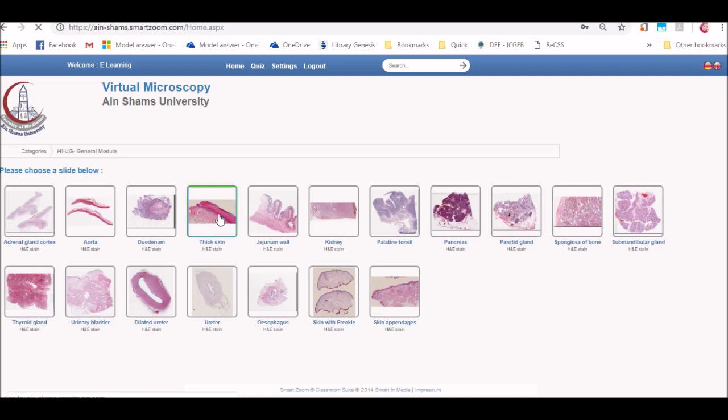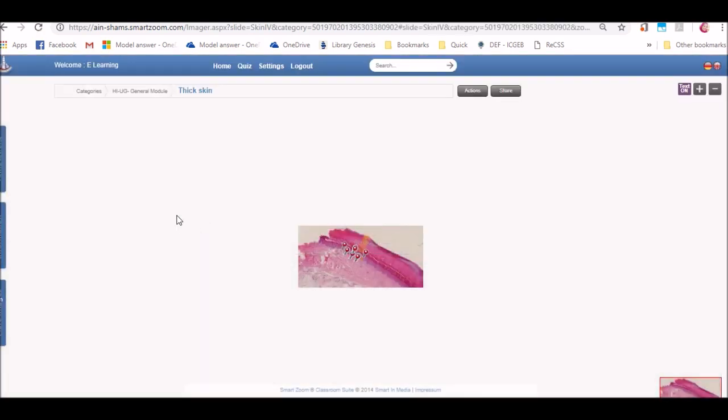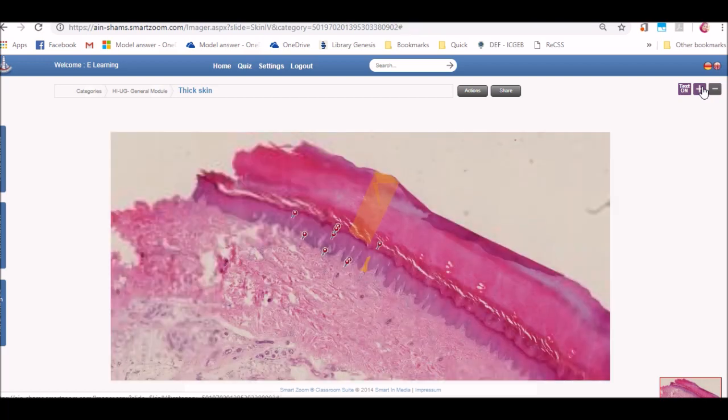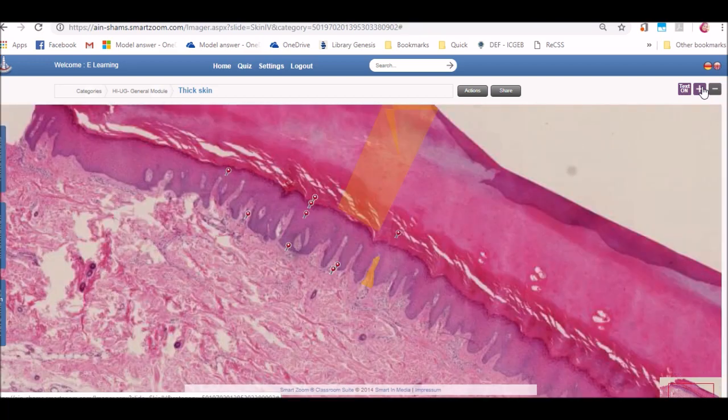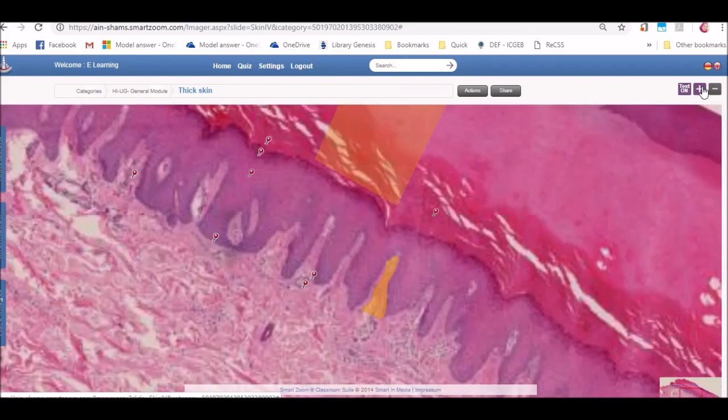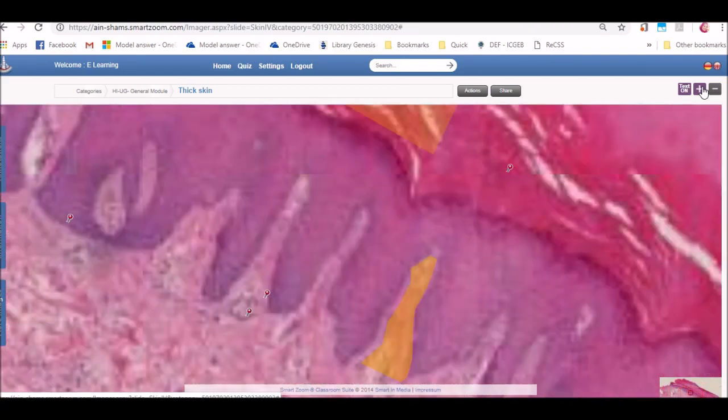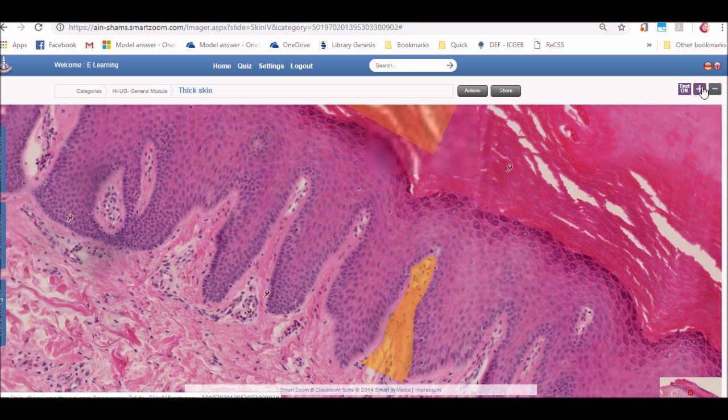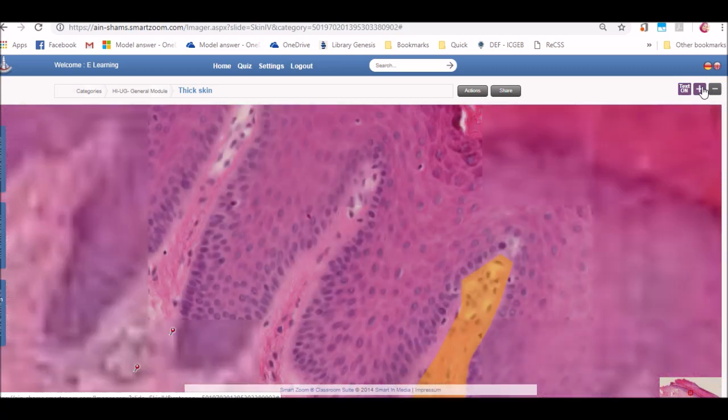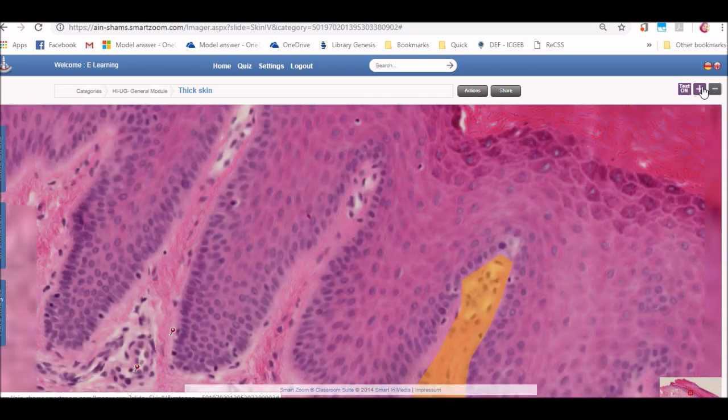The virtual microscopy application enables you to inspect a slide as if you are sitting in front of a microscope. So you can zoom in to the highest power under the microscope and zoom out also to the lowest power in the microscope. You can zoom in and out by using the plus or minus buttons by clicking on them, or by using the touchpad, or by using the scroll of the mouse.